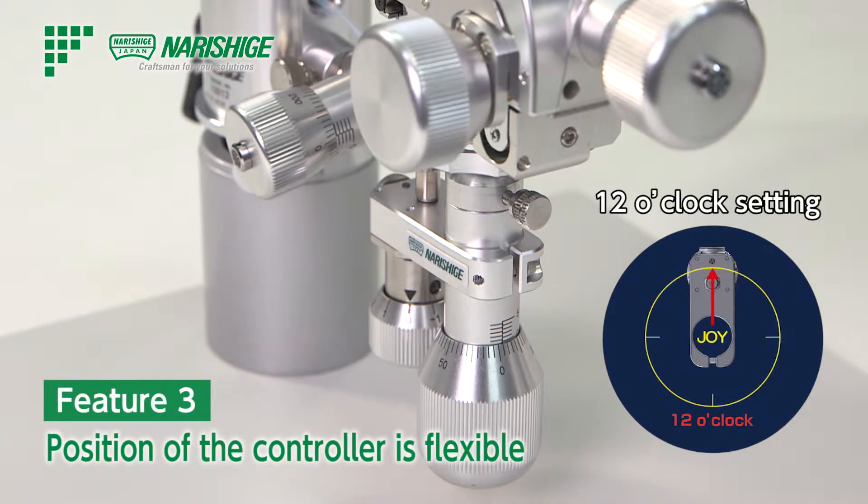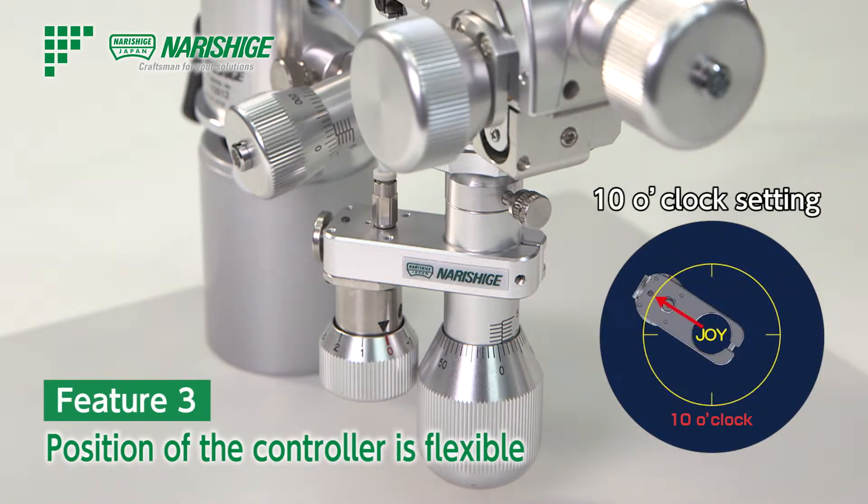It can be placed in either the 10 o'clock or 12 o'clock direction, depending on the user's preference. 10 o'clock is the recommended direction.